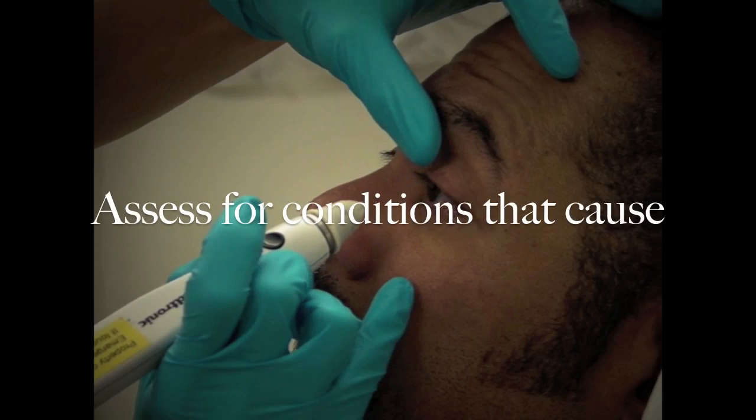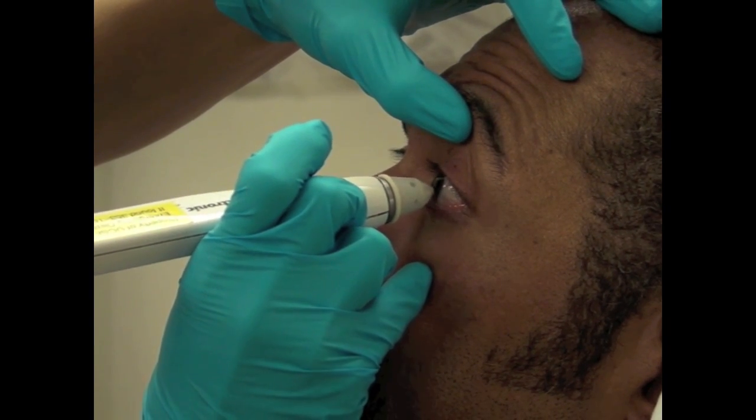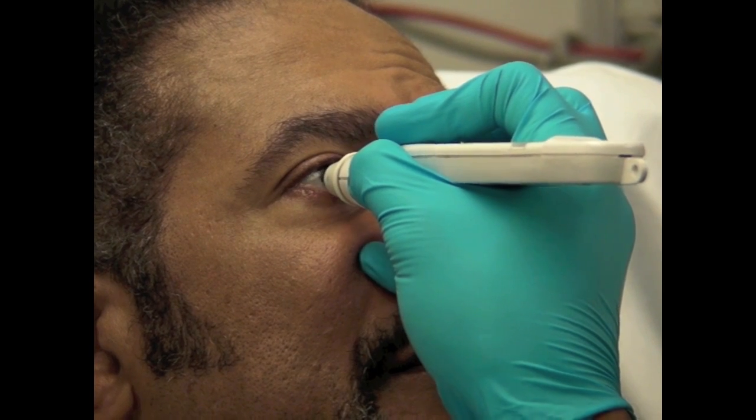In the ED, tonometry is used to assess for conditions that cause increased intraocular pressure such as acute angle glaucoma and iritis. It may not be safe to perform tonometry in patients with a corneal defect as it may lead to further corneal injury.